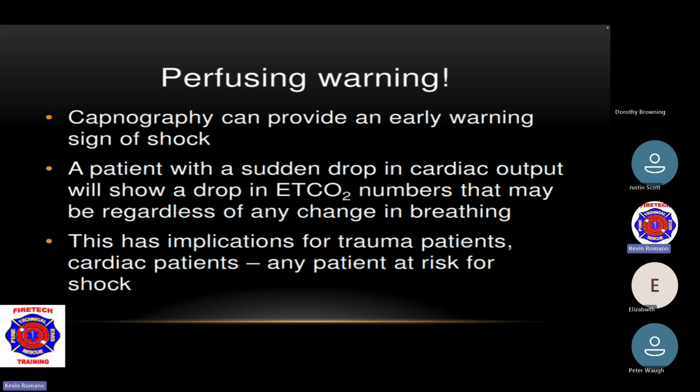This has an implication for trauma patients, cardiac patients, and any patient at risk for shock. So again, you're going to see that sudden drop in cardiac output will show a drop in end-tidal numbers that may be regardless of any change in breathing status. Right. So again, we got to kind of pay attention to that.